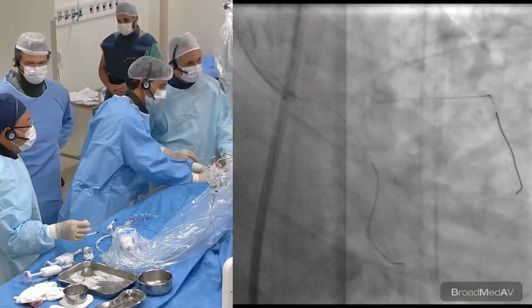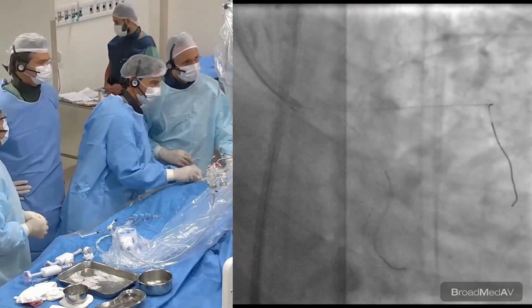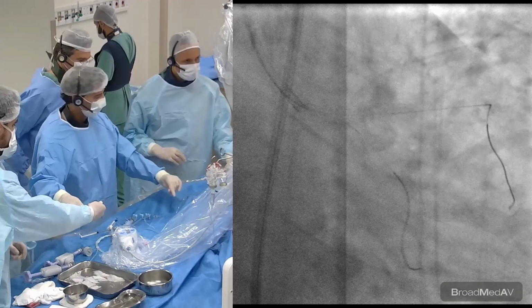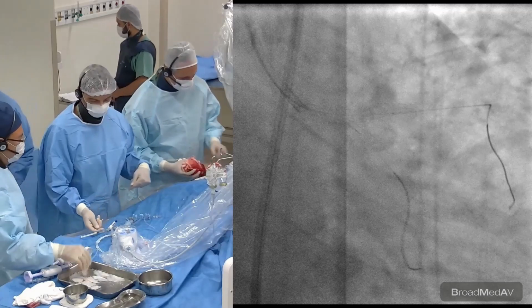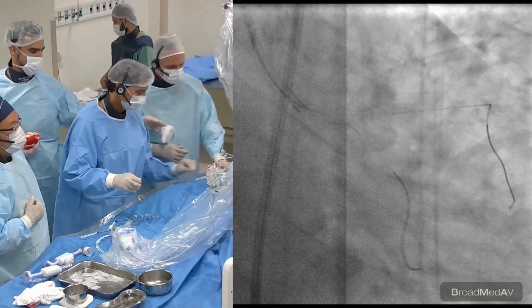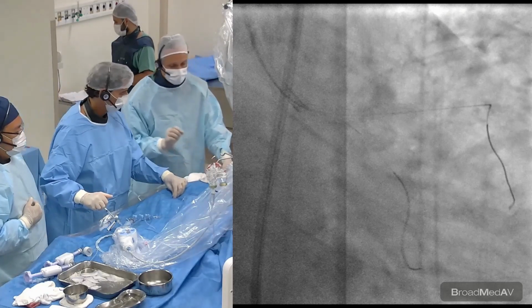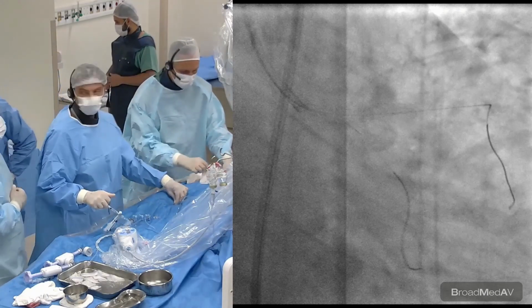Louis, do you think we need to do an extra work after IVUS, or are you going to stop? No, I will do only... I'll probably do a POT. Why not do a POT, Ricardo? That's controversial, even between the stenting operators here. It's great, we could have back the circumferential geometry, but one tip now is for you to do the kissing balloon not extend too much into the carina. Just take short what we did here. So maybe POT is less needed.